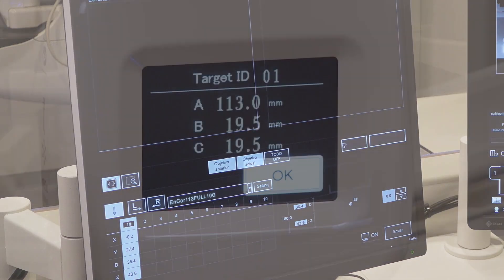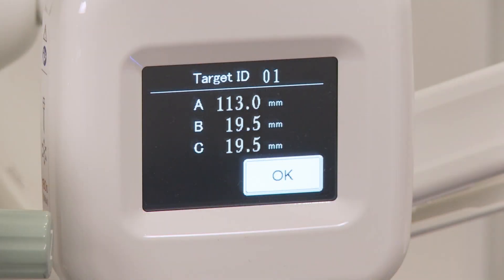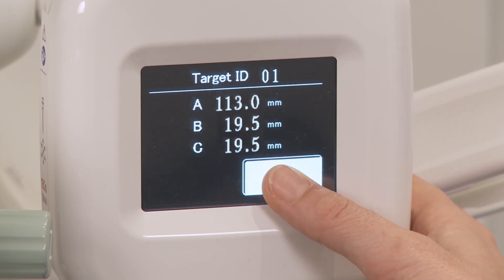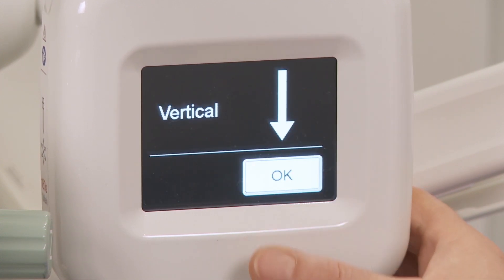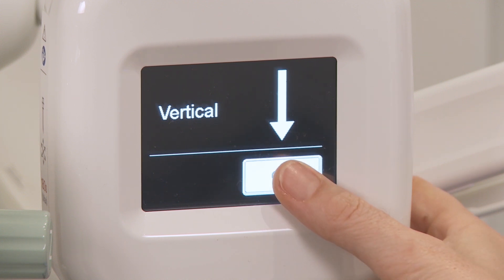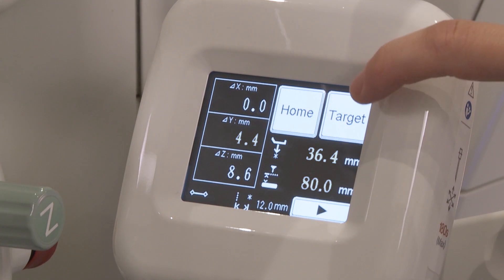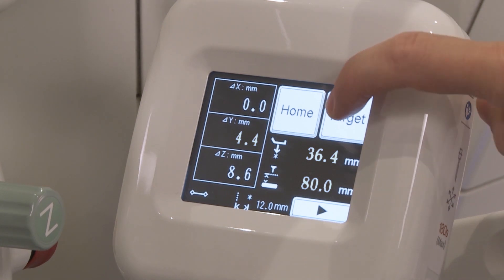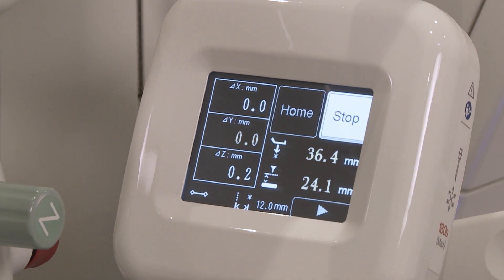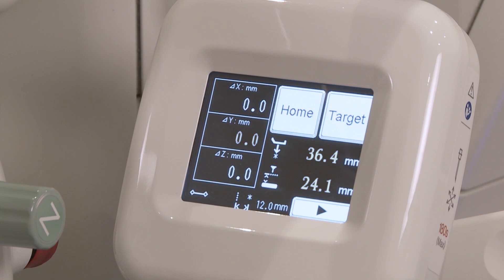In the Operation panel, the target information is displayed right after touching OK to confirm the target ID and needle, and OK again to confirm Vertical Approach. Press the Target button to drive the needle holder to the selected target coordinates.